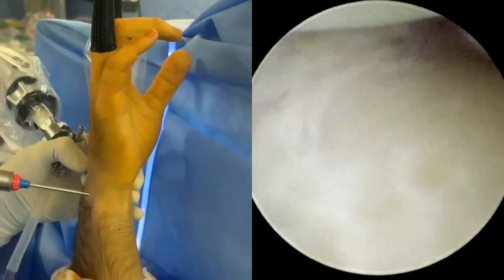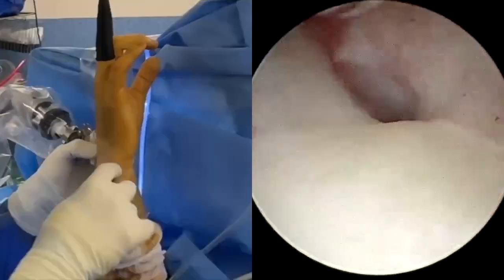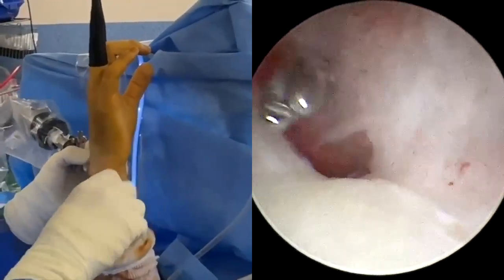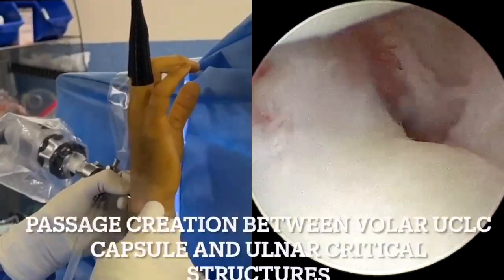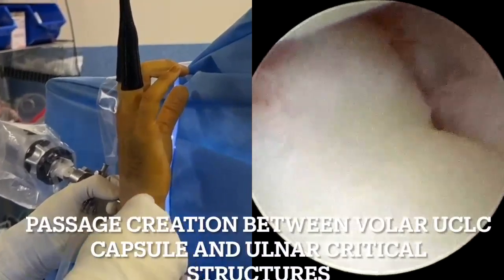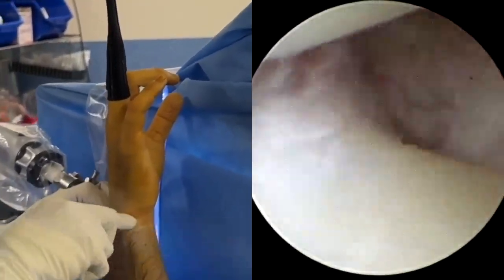An arthroscopic debridement is then performed using a shaver. A 6-U portal is created with a curved hemostat, taking care to avoid damage to the dorsal sensory branch of the ulnar nerve. A passage is then created between the volar capsule and the ulnar neurovascular bundles.